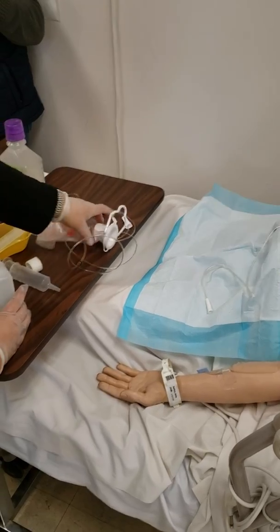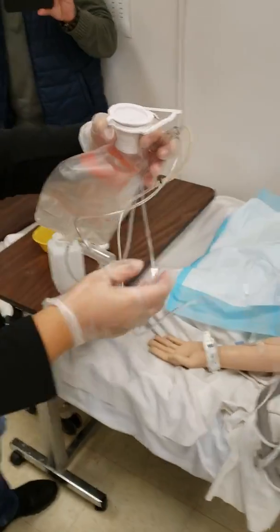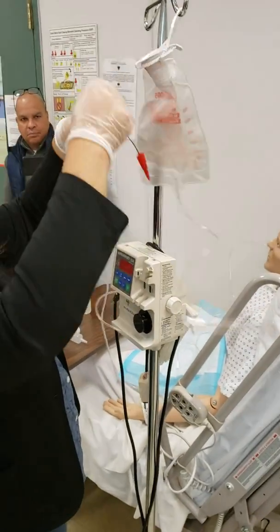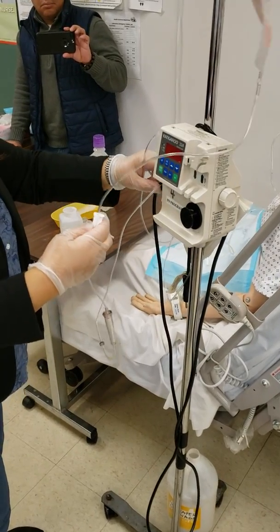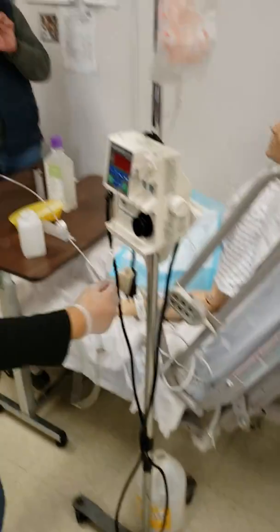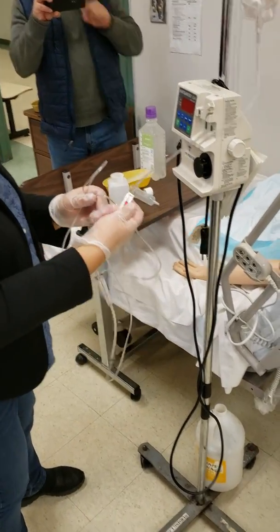you will hang this. Be careful, right? You can hang it over here. And then we will make sure that this is closed. So make sure this clamp is closed, right?